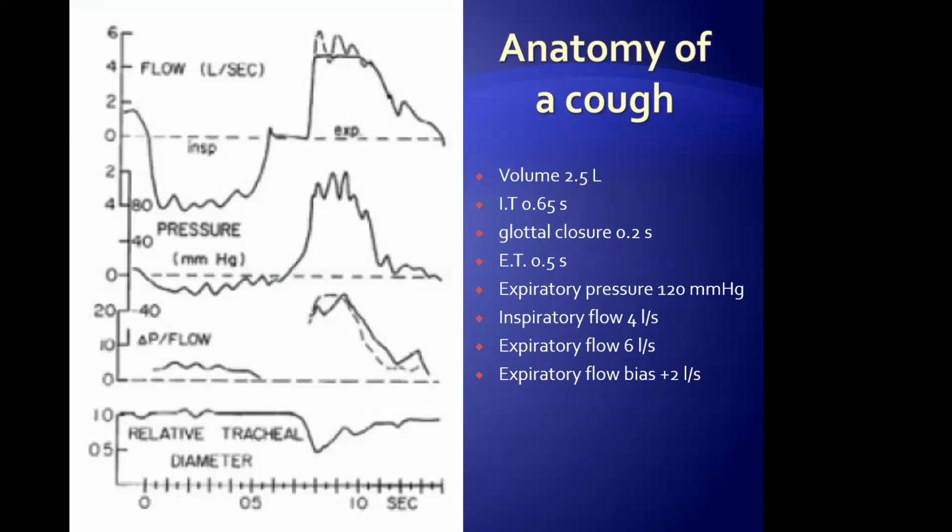Again, we understand this, but I built this slide just for the waveform so we get a visual of what that looks like. When you're placing your healing hands on a patient and having them take that big deep breath in, you're looking for bilateral chest wall movement and all that stuff. And then you have them cough, it vibrates their hand. This is what it is. It looks like that. So there's the visual that goes along with the actual.